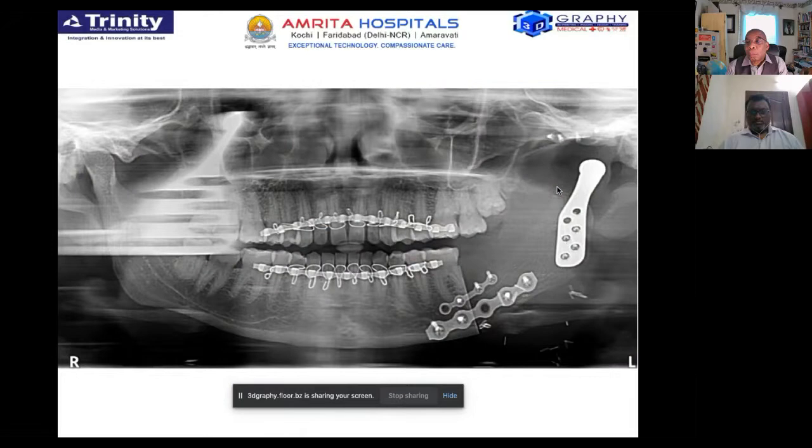But the issue that we haven't faced, but what we think is that stock joints are very unpredictable at times, because with a bit of position change, you may end up getting fewer screws on the bone. So we were quite concerned that if next time it does not go as per plan, we may end up placing just the bone and not the joint.